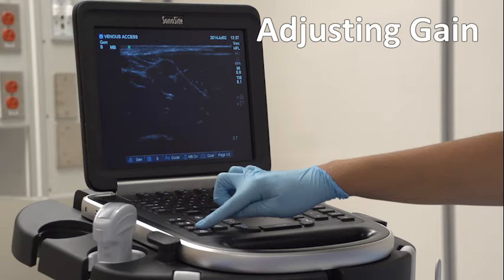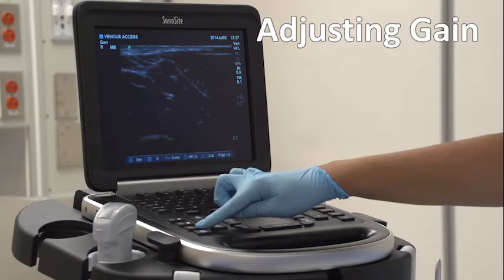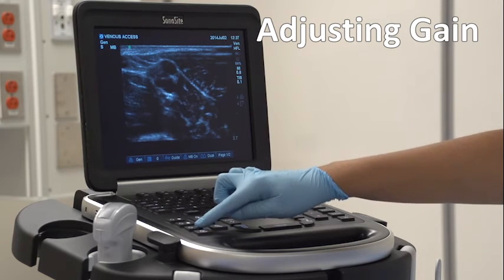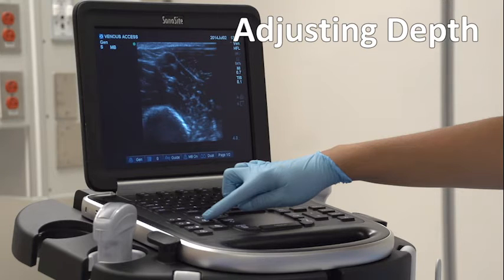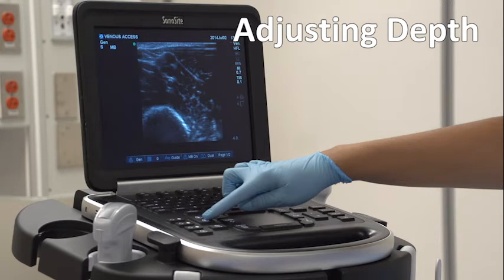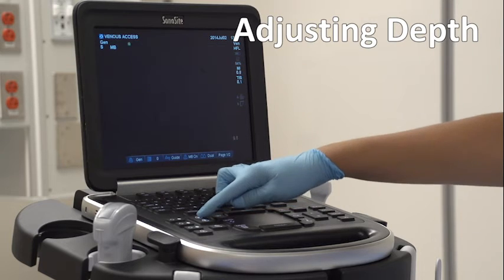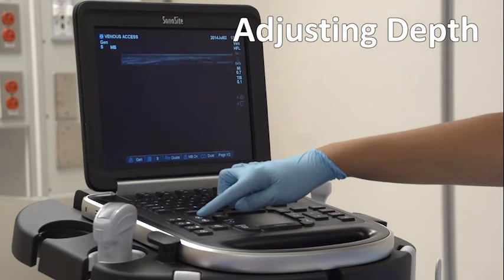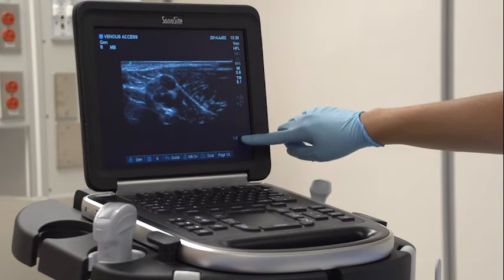After you've identified the target vessel and confirmed patency, optimize your image using depth and gain adjustment. Use the gain button or dial to adjust the gain such that the blood inside the vessel appears completely anechoic or black and the surrounding tissue is gray. Use the centimeter markers on the right side of the screen to determine the depth of your vein of interest, and confirm that between the skin surface and the vein, no important structures such as nerves or arteries exist in your planned path of needle puncture.